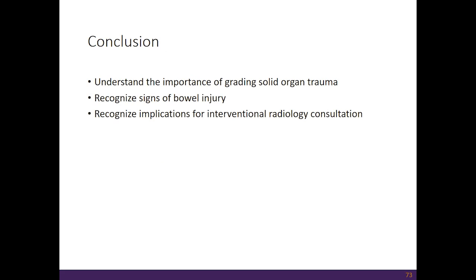So in conclusion, hopefully you understand the importance of grading solid organ trauma. You can recognize some of the signs of bowel injury and recognize the implications for interventional radiology consultation from the initial imaging. Thank you.